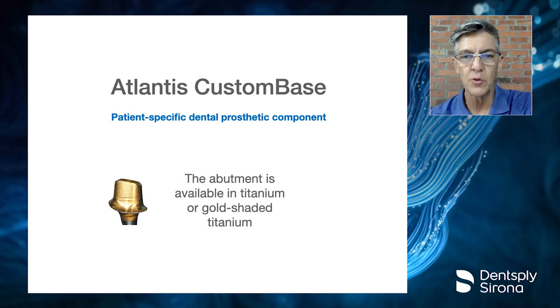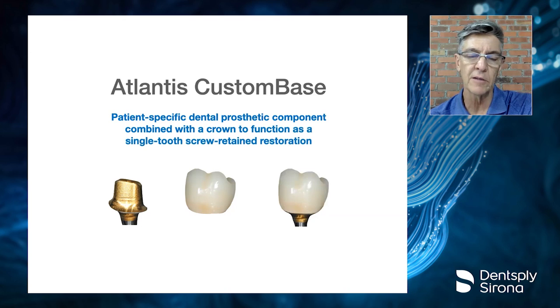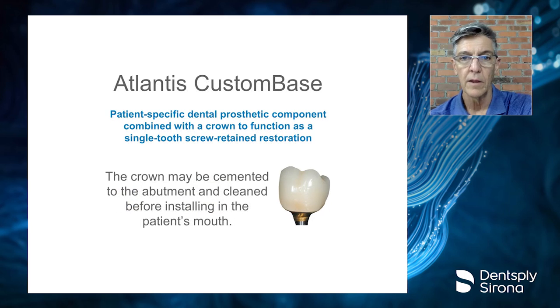Now, this starts with an abutment, and this is a custom-made titanium abutment that is designed for screw-retained crowns. We are able to have crowns made to fit really perfectly to the abutment because it's made from a core file. And then the crown is combined with the abutment to create a screw-retained restoration. Now, the crown may be cemented out of the mouth, which is great because we can eliminate the problem with cement contamination that we often will have when we try to cement a crown in the mouth.